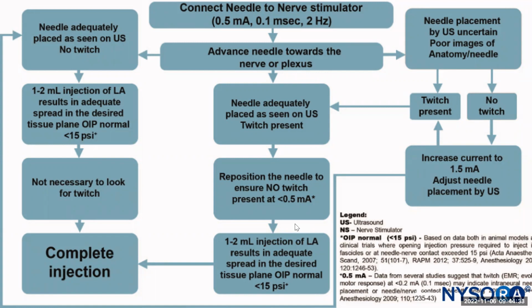So ultrasound paired with stimulation is a very good technique. If you're used to doing stimulation and you want to incorporate ultrasound, it's okay to use both techniques. Again, make sure that your ultrasound anatomy looks good and that your stimulator's properly functioning. If you can pair those two together, you can enhance your ability to place these blocks.